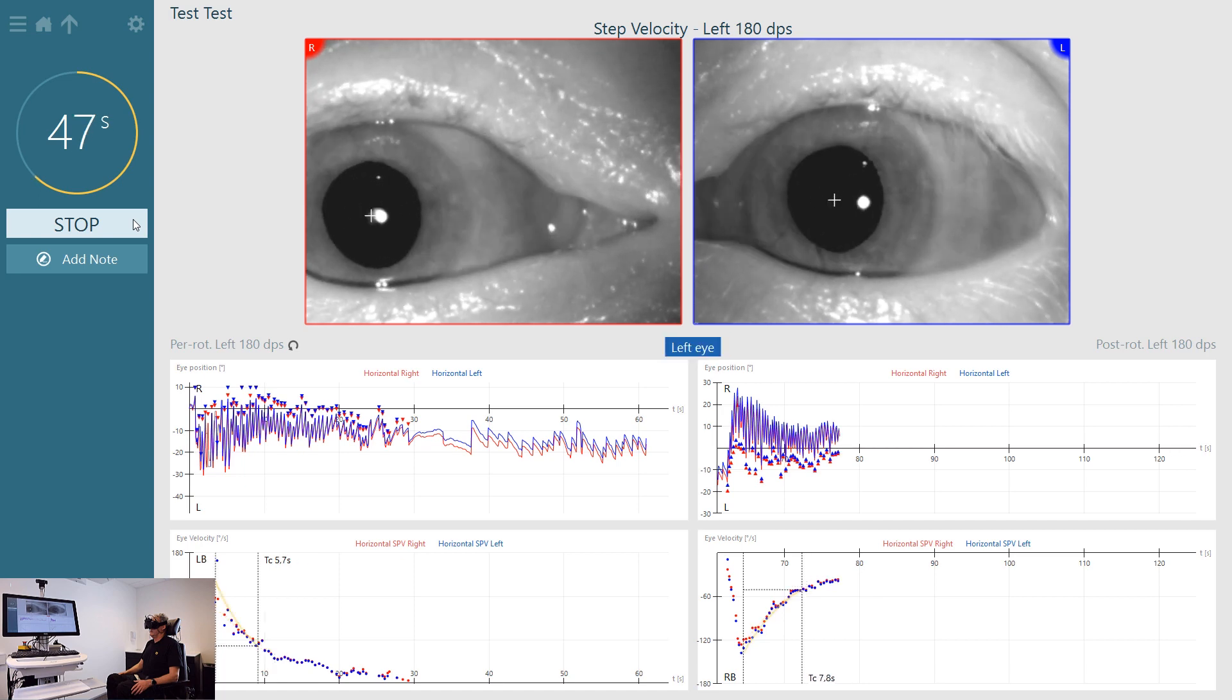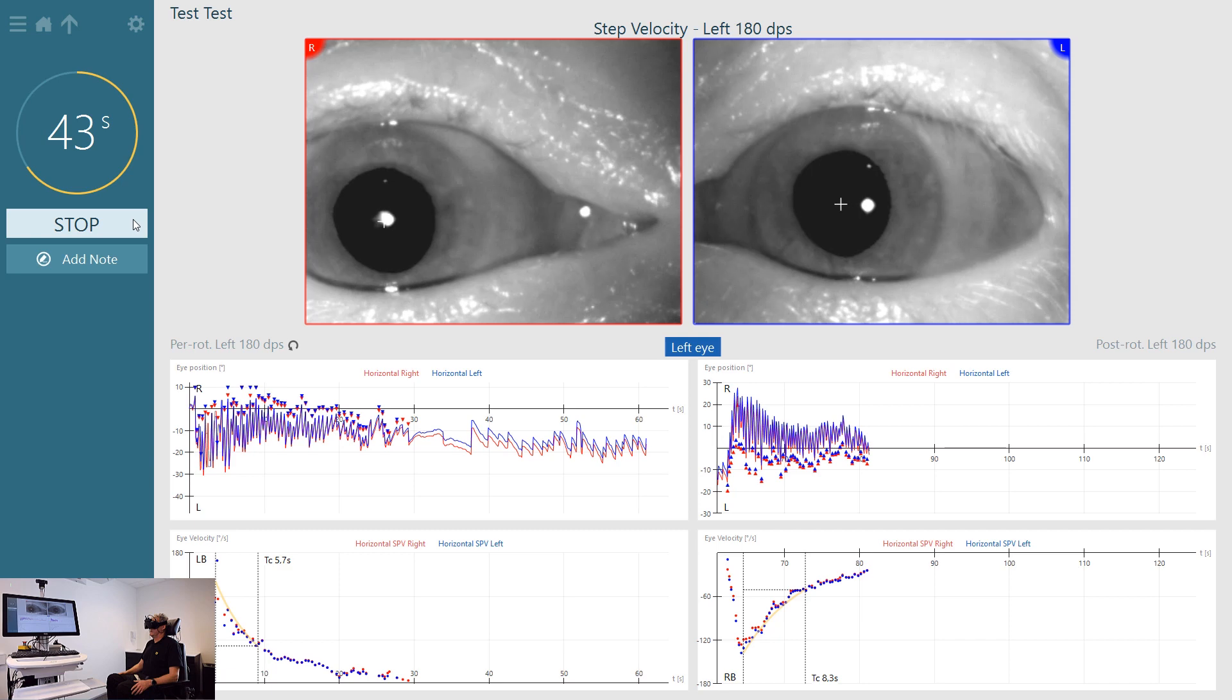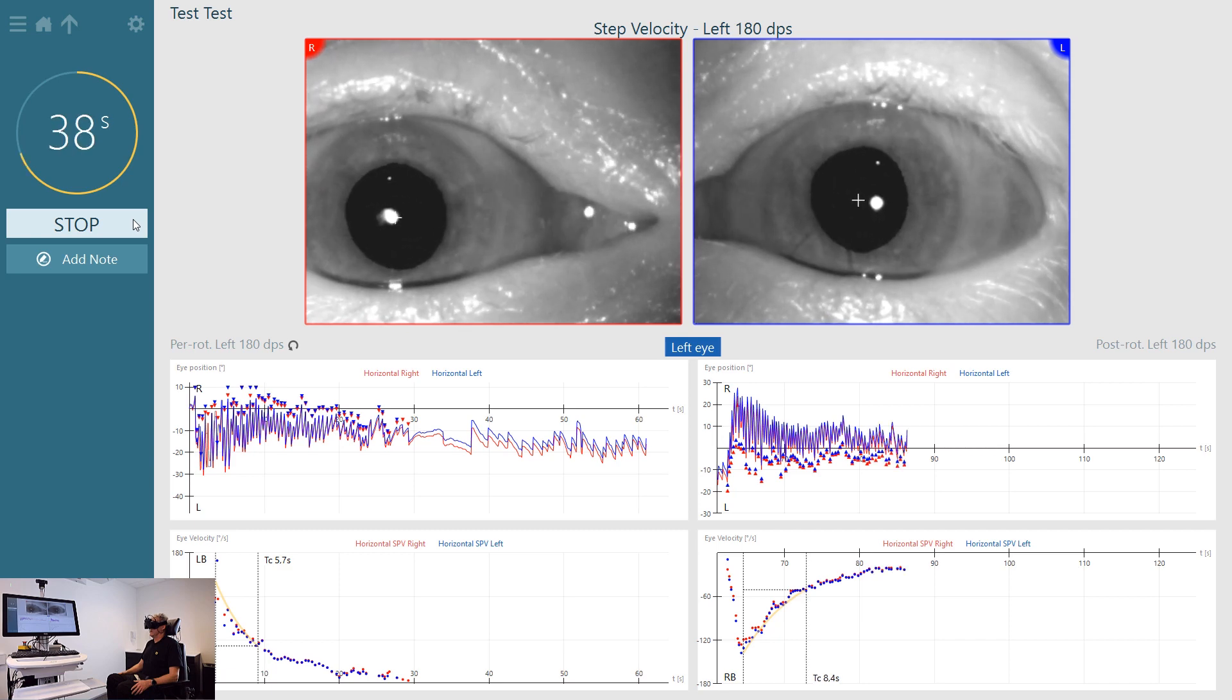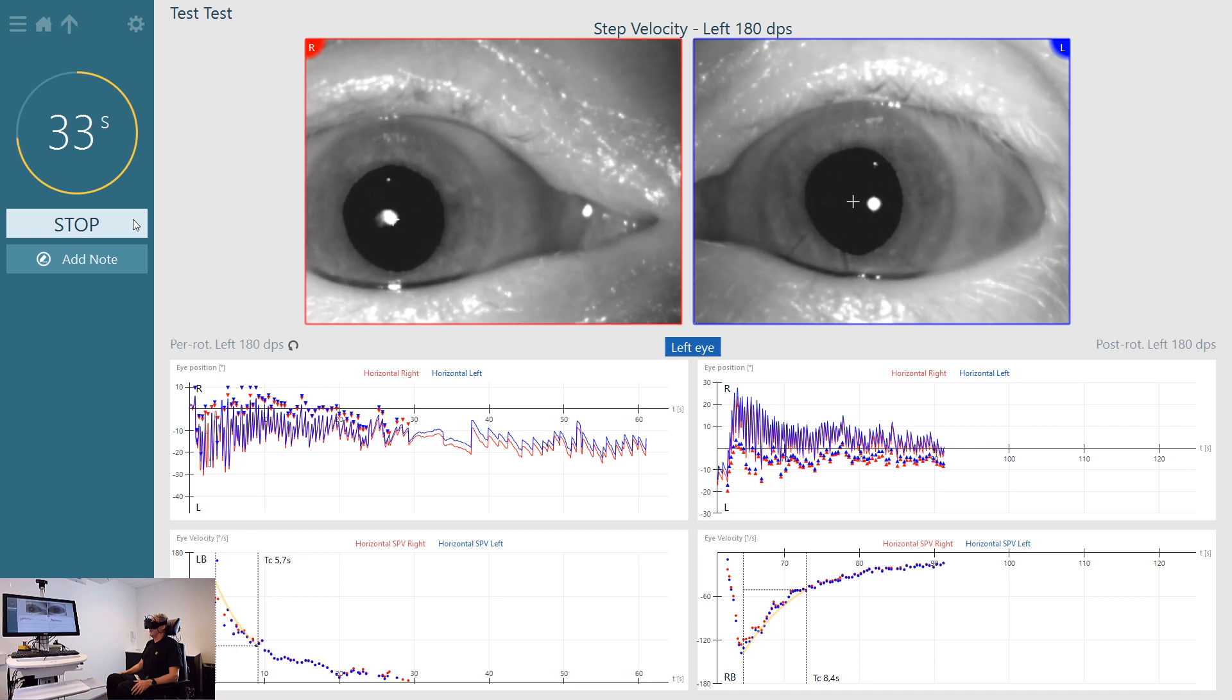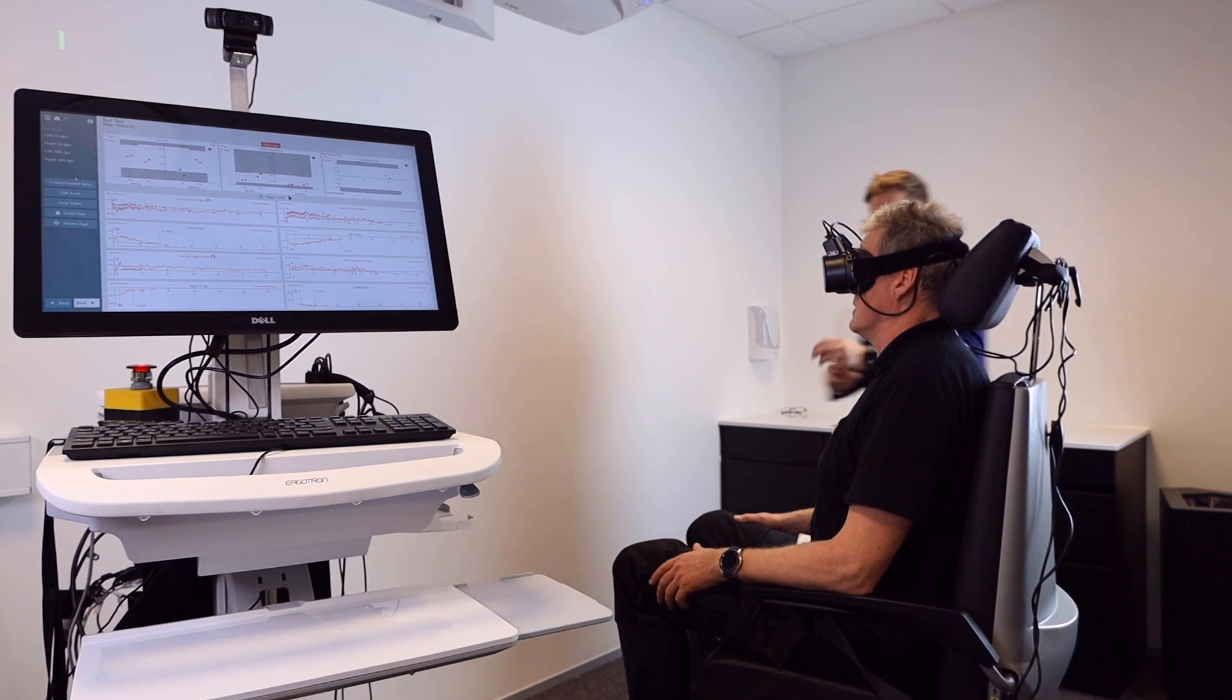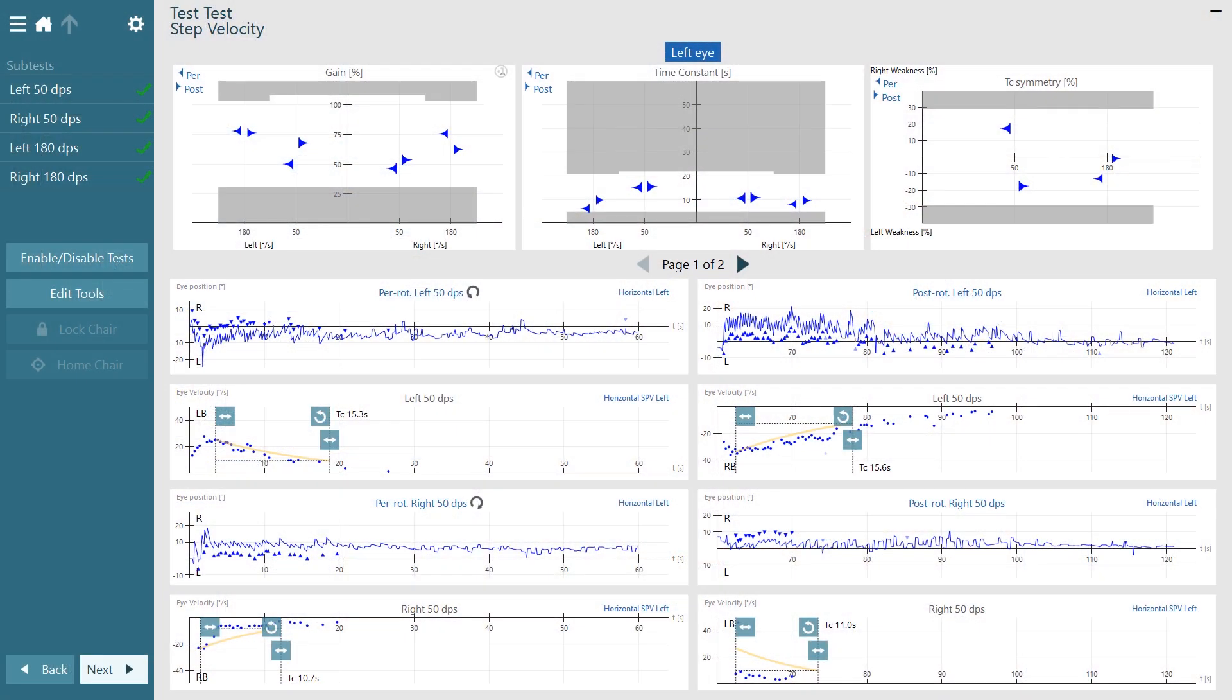Although nystagmus is still generated for a longer amount of time than in the low velocity test, we are still using the time constant criteria of reduction to 37 percent of peak slow phase velocity, or a reduction of 63 percent. When measurements are completed at a slow and high velocity in both directions, we can remove the goggles from the patient and begin to review the results.